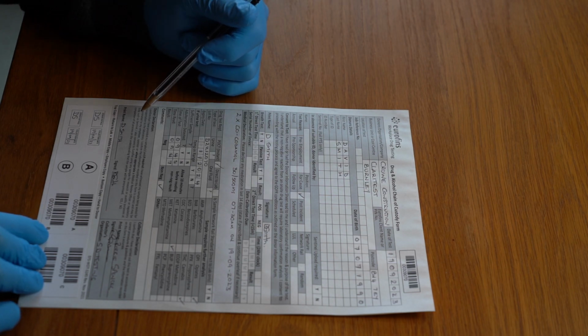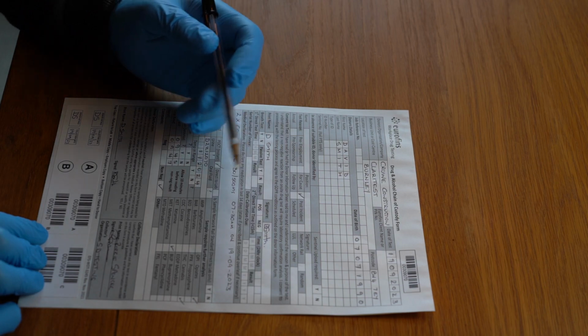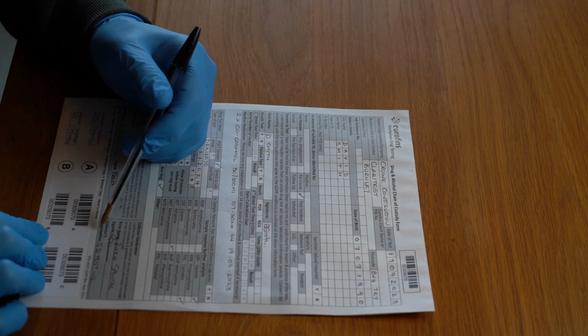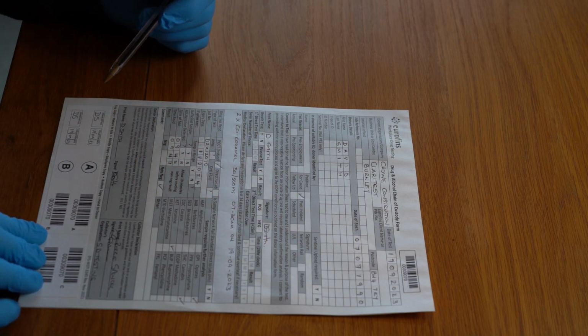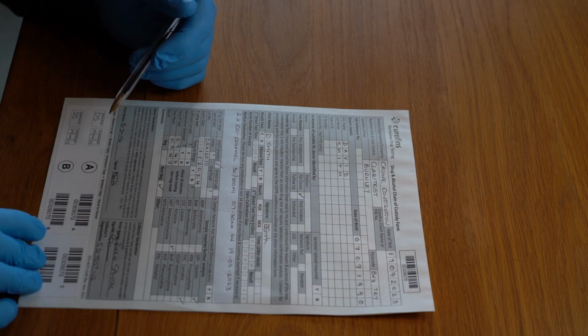I then read the donor declaration to them and asked them to print their name and sign it. I then, as the collector, put my name, signed it, and my collector's organisation, which is simply SD testing. And the last thing I then asked them to do was to initial and date the 2 tamper-proof evidence seals at the bottom, one marked A and one marked B.